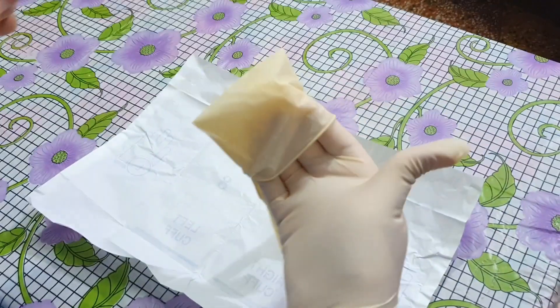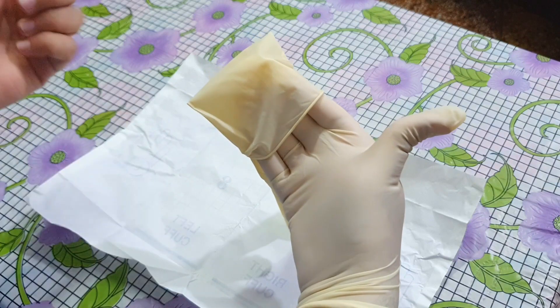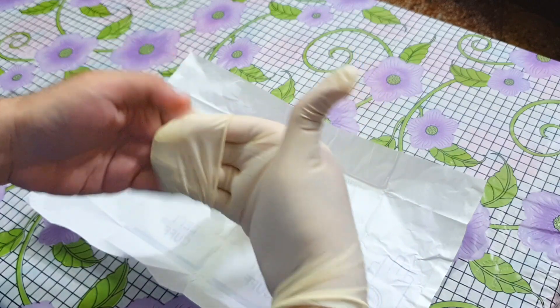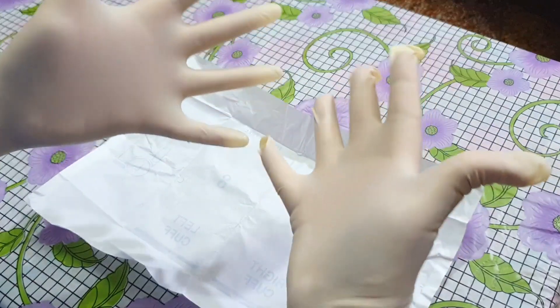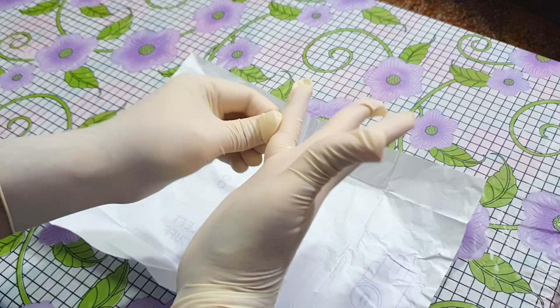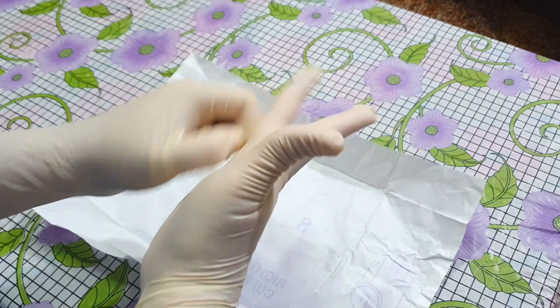Now hold the other glove like this. Note that my sterilized outer surface of the right hand is only touching the sterilized outer surface of the left glove and not touching its inner surface. The inner surface can only be touched by my left hand. Now I will slide in my left hand into the left glove and put it on. Once both gloves are on, correct the imperfections around the fingers so that they properly fit. The outer surface of both hands is sterilized now, so they can easily touch one another without an issue.